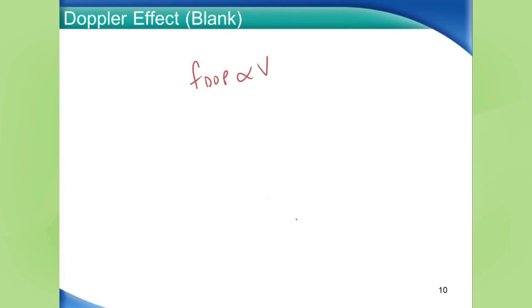Well, we also just said that the Doppler effect is caused by a change in wavelength. So I have a basic theory here that says basically anything that affects the wavelength is also going to affect the Doppler shift. And we know the equation for the wavelength is lambda equals c over f. So we know that both c and f are going to have to be in the Doppler equation. And we know one more thing. Because they both impact the wavelength in opposite directions, wavelength is proportional to c and inversely proportional to f, they're going to be on different parts of the equation.